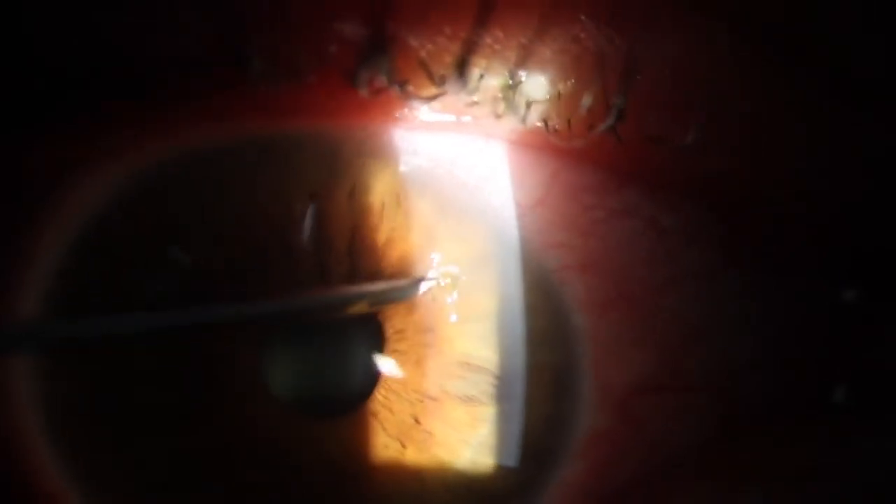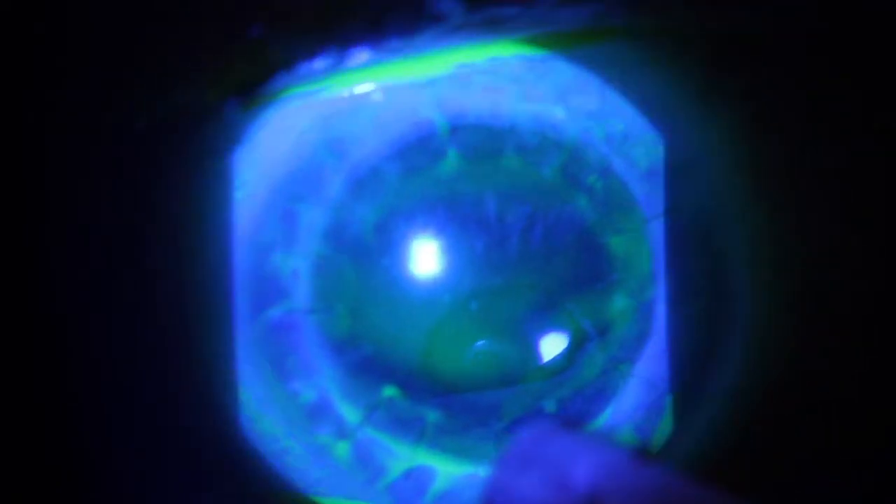It's also important that the fornices are examined thoroughly and the upper lid is averted to ensure there's no hidden foreign body.